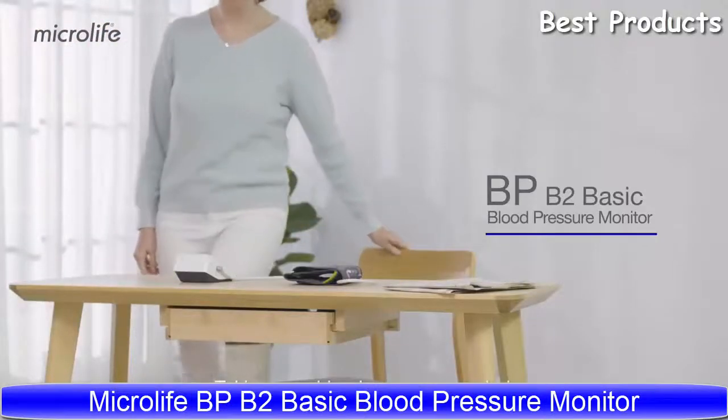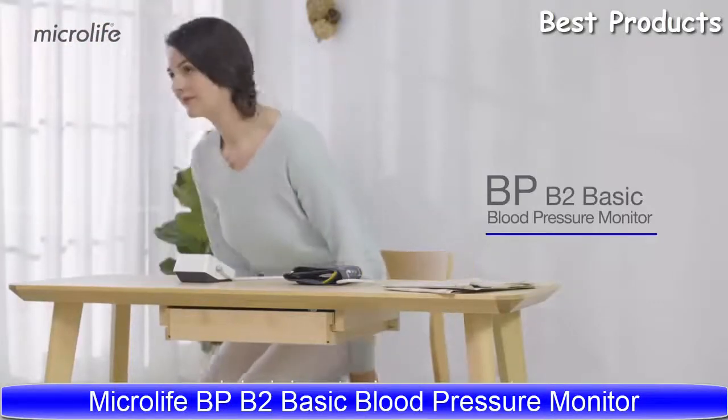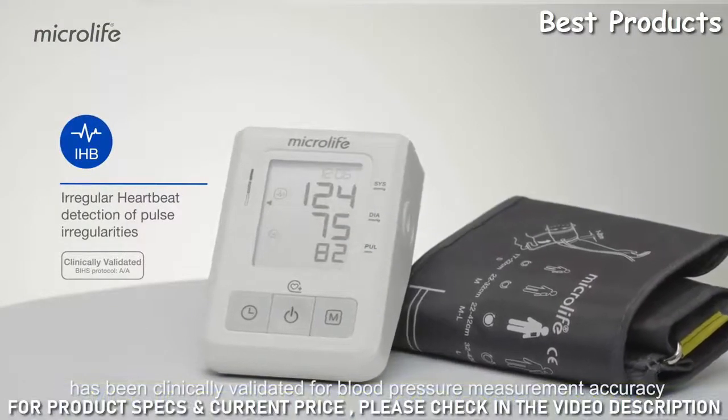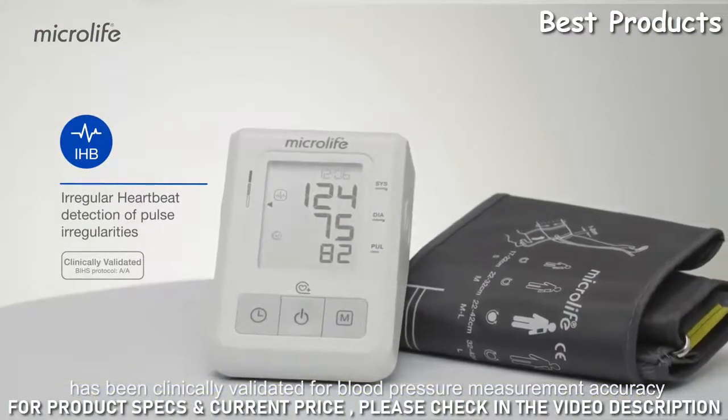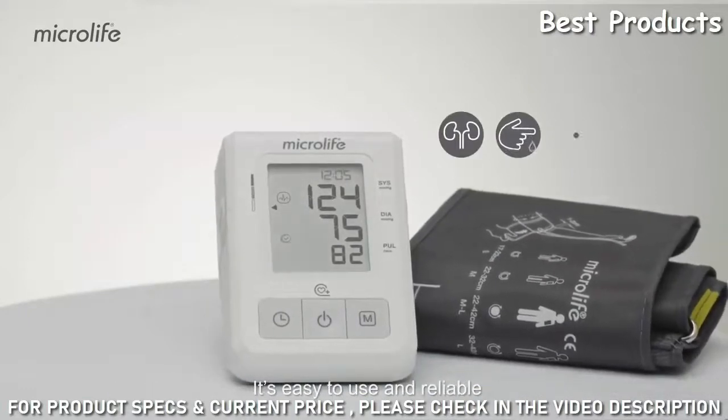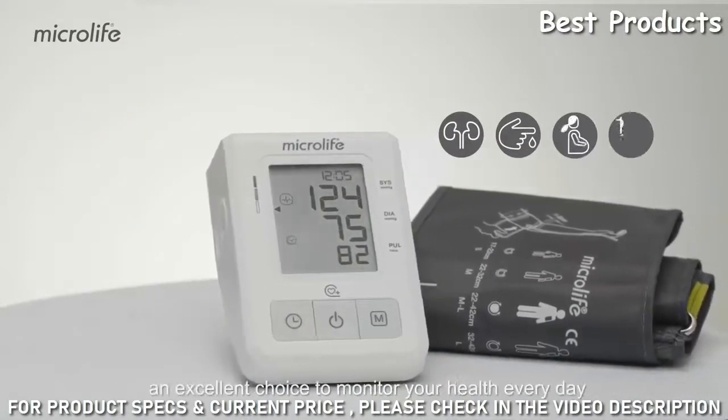Taking your blood pressure regularly helps in hypertension management. The Microlife B2 Basic has been clinically validated for blood pressure measurement accuracy in the general population and for groups with special conditions. It's easy to use and reliable — an excellent choice to monitor your health every day.